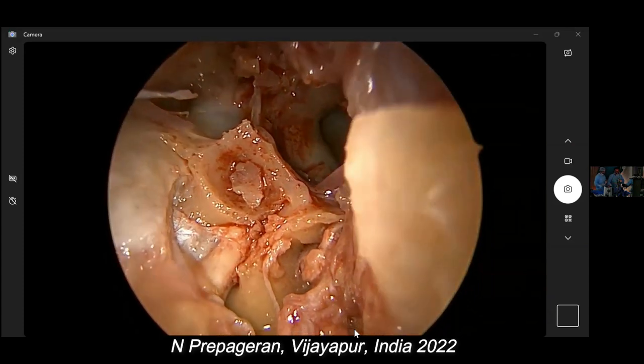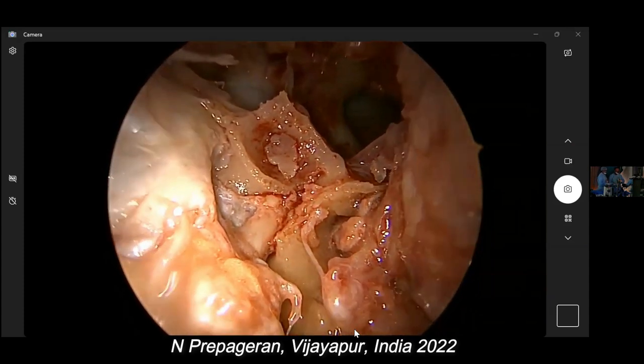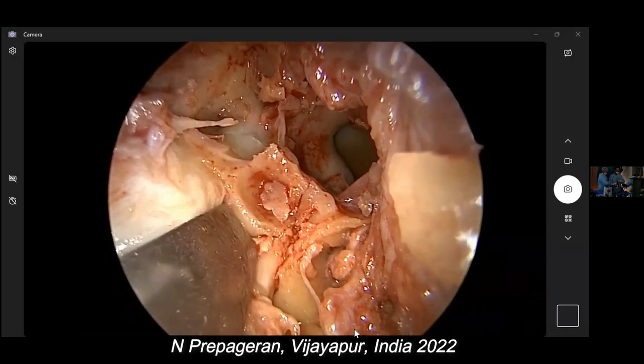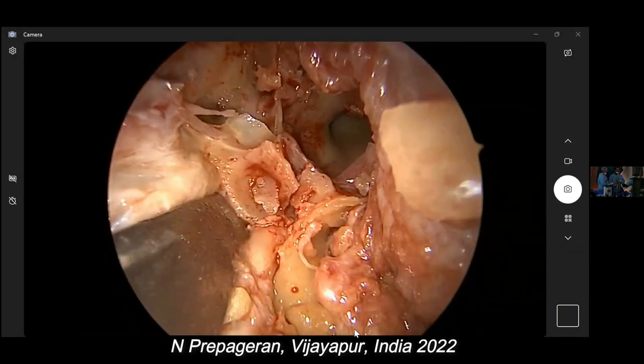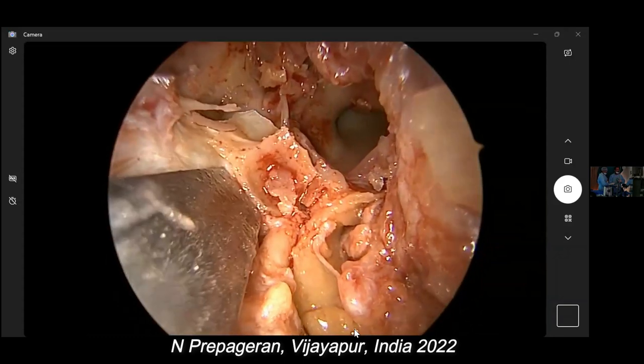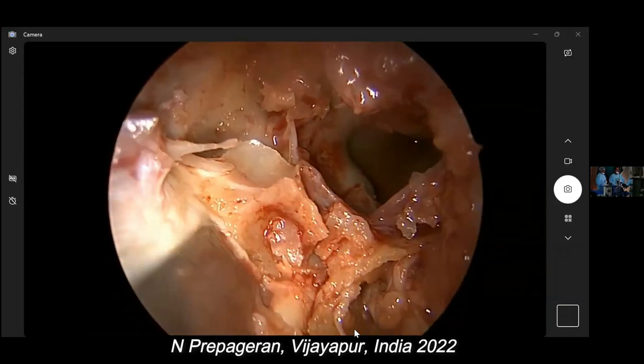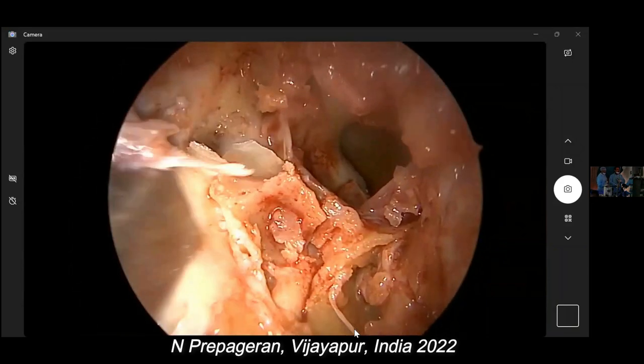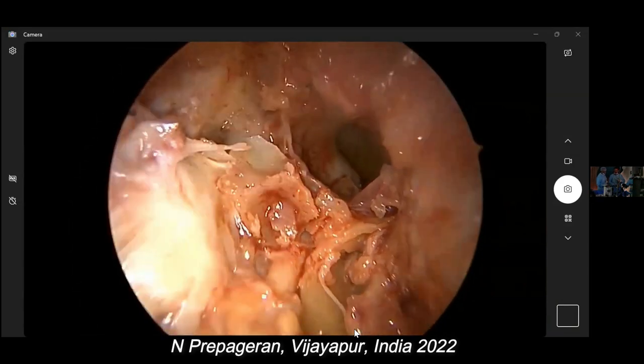Clear, sir. Orbital fissure. Okay. So now, if we remove this bone, usually it's not so hard, okay? Hold the head up, boy. Come on. Oh, okay, beautiful. Wow, Shashi. I think you should be a sculptor. Your chisel is very effective. Maybe you shouldn't eat lunch every day. You seem to be better without lunch.